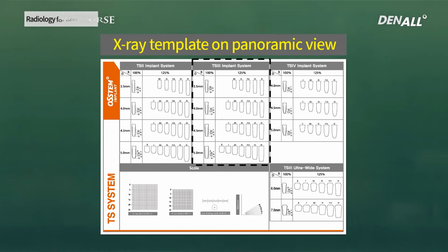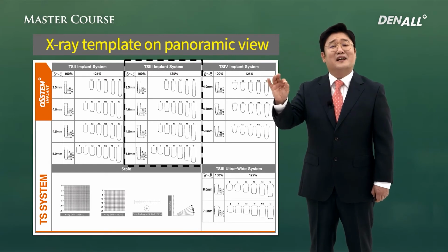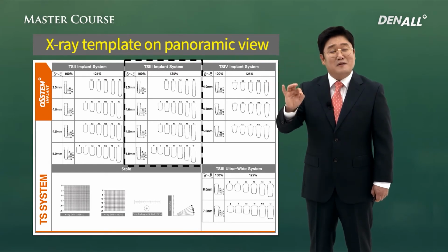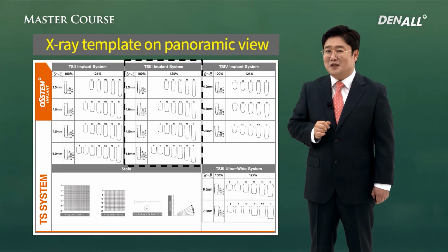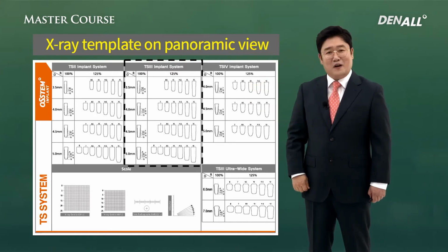The defective region's bone height can be measured, as I said. They are not measured just with a ruler. X-ray template is used for that purpose. In Korea, a digital trend is very strong today, so bone height can be measured with the program, but still in many other countries, X-ray template is in use.